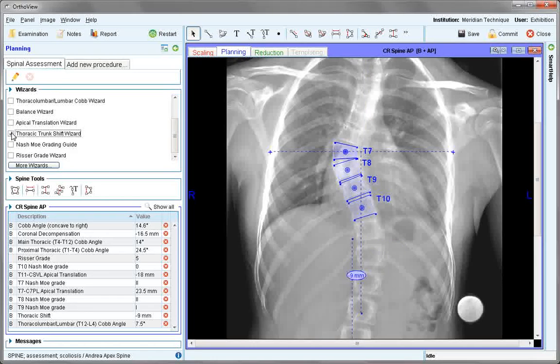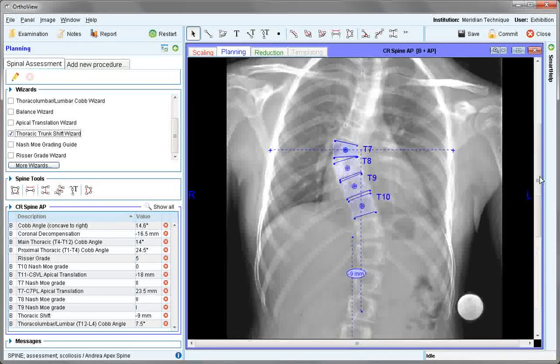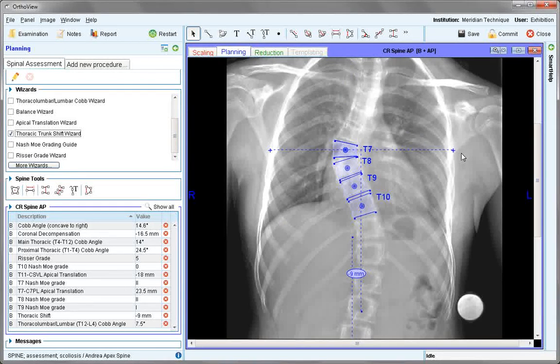The thoracic shift wizard also uses similar reference points, with S1 being identified and the most lateral point of the rib cage on either side through the apical vertebra. The thoracic shift is then measured by bisecting that line.